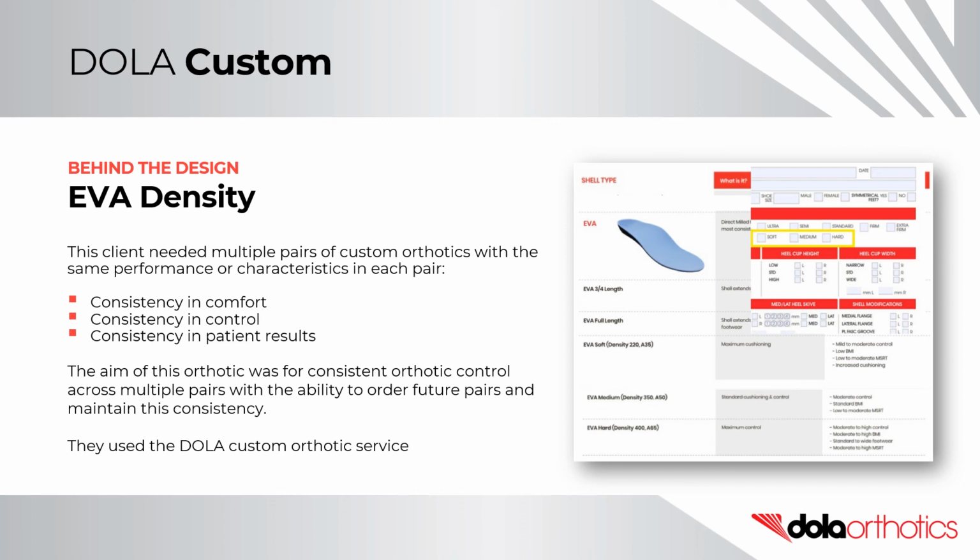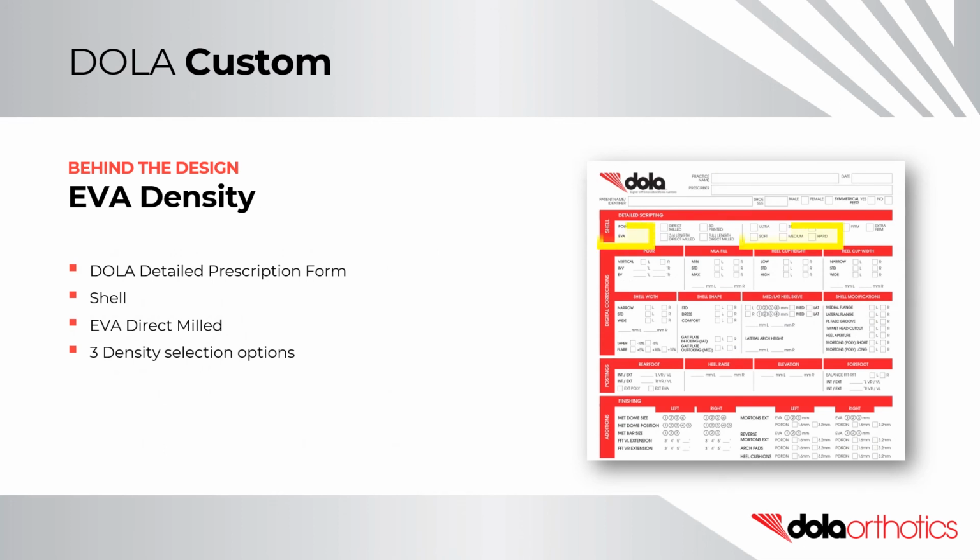They used the DOLA Custom orthotic service. They were able to select from 3 consistent density options in the EVA direct mill section of the DOLA detailed prescription form.